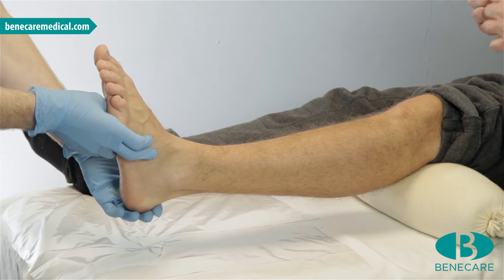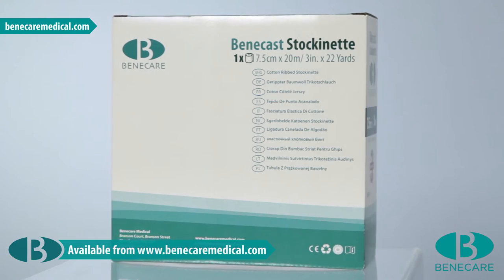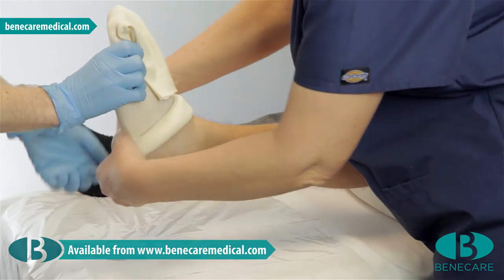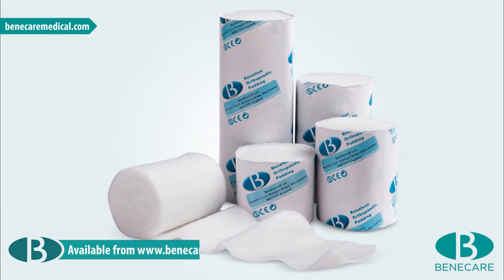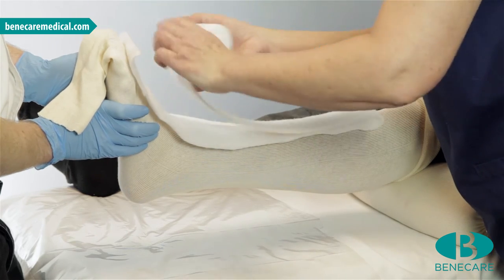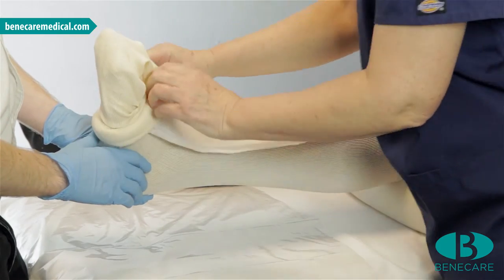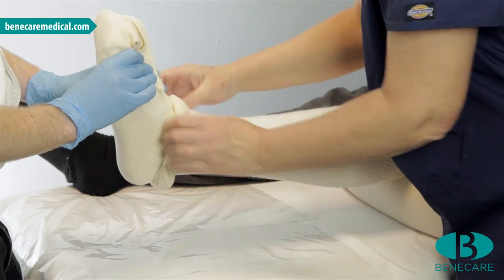Position the limb and ask your assistant to maintain the position throughout the application. Start the cast by applying one layer of stockinette to the limb, extending from the tibial tuberosity to the end of the toes. Now apply a second layer of stockinette as with the first. Roll it onto the limb; it is imperative this is smooth and wrinkle free.